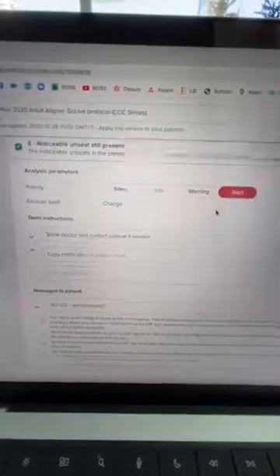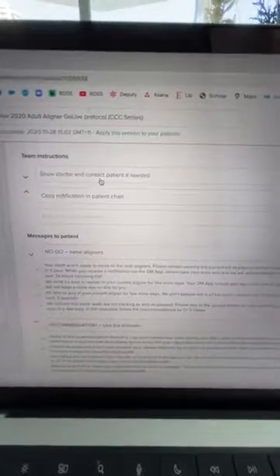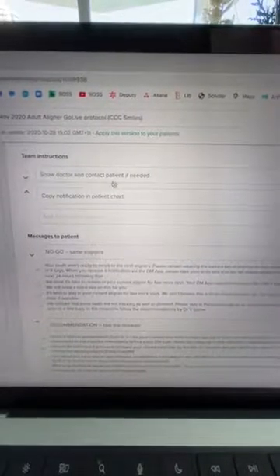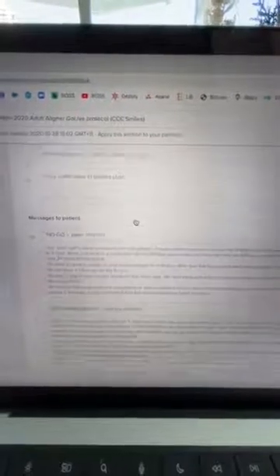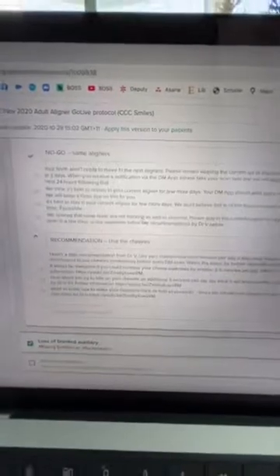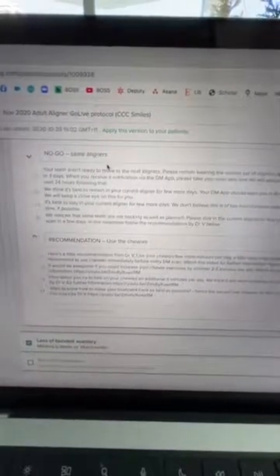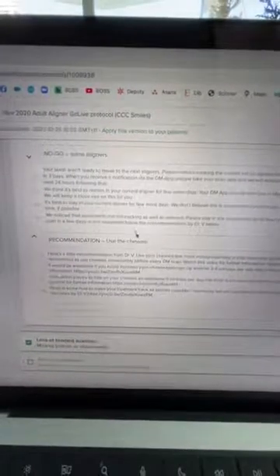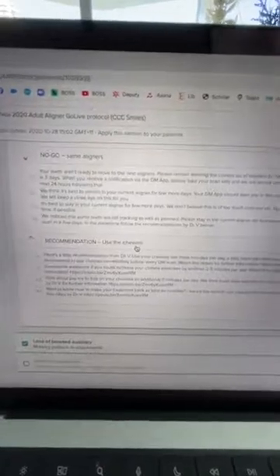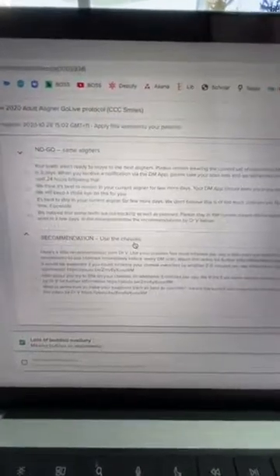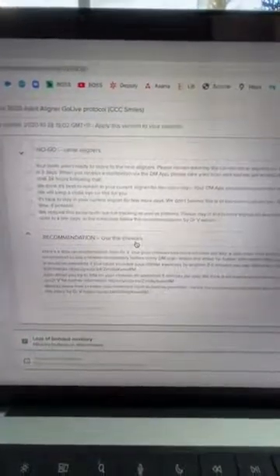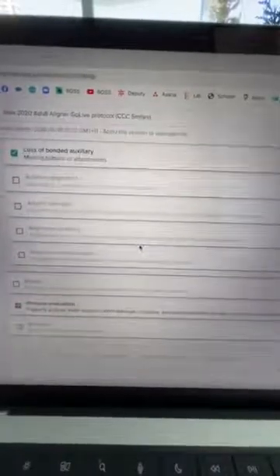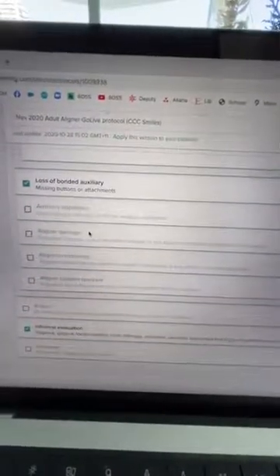What if the noticeable unseat was still present at the subsequent scan again? Well then definitely it's a red alert for me. I want notification tab to pop. I need the doctor, so I need to see this patient ASAP. Obviously we want the patient to not change their aligners and stay in that current aligner.